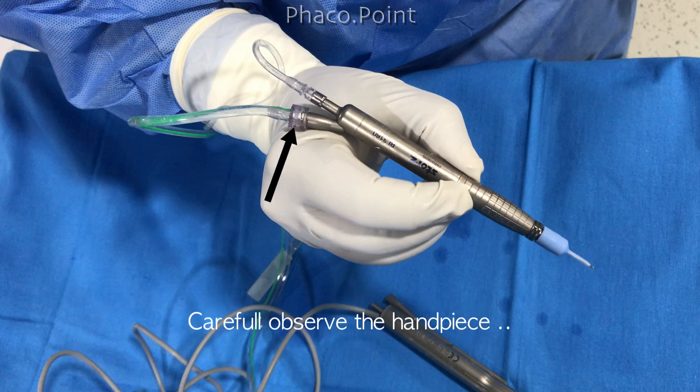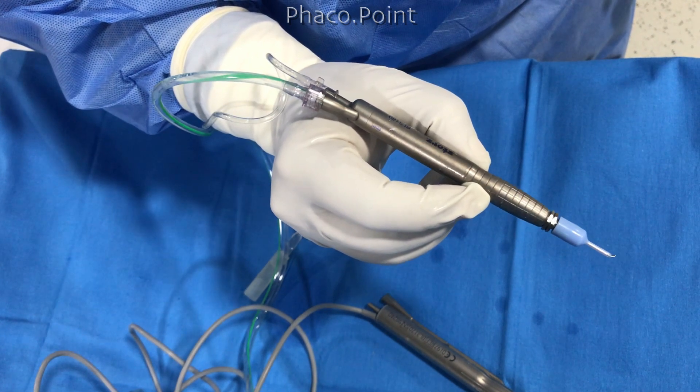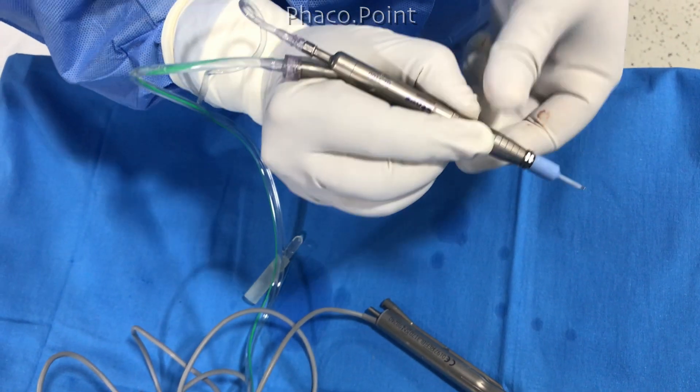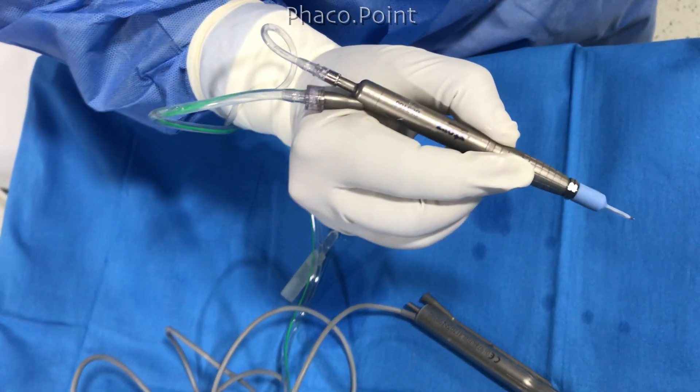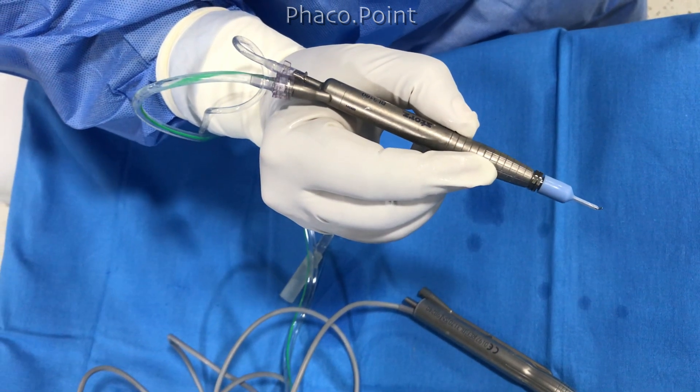Carefully observe the handpiece as I relax the grip. You see how the handpiece is auto-rotating? I'm not rotating this coaxial IA probe at all. You just take a hold of it in the correct position with the aspiration port facing up, and when the grip is relaxed there's an auto-rotation of the handpiece. This means that there is torque.